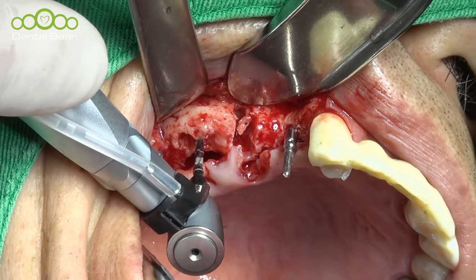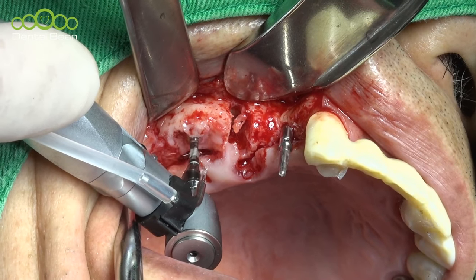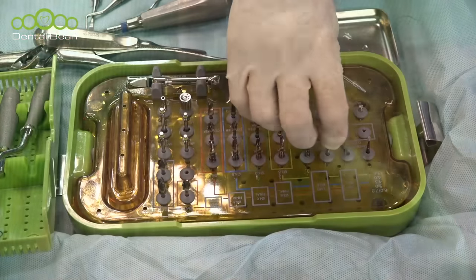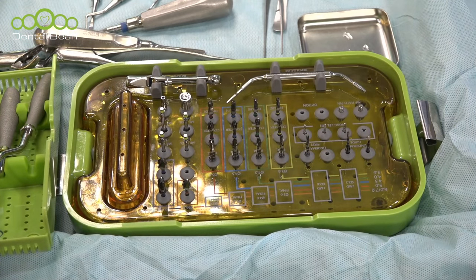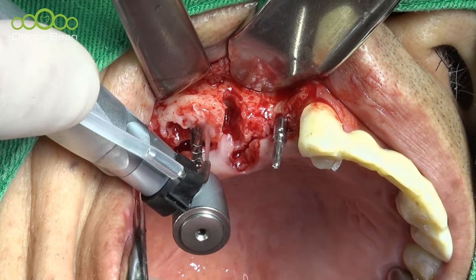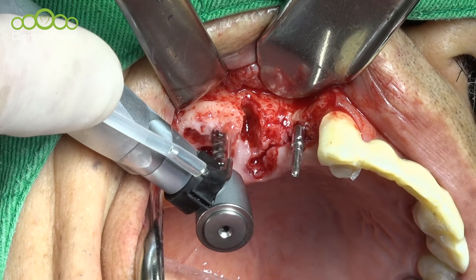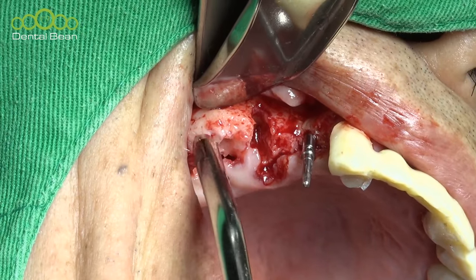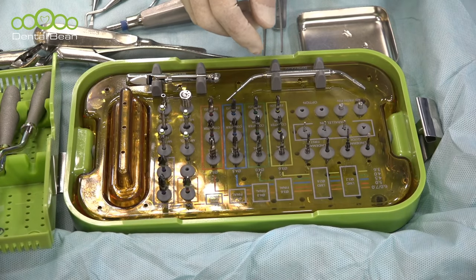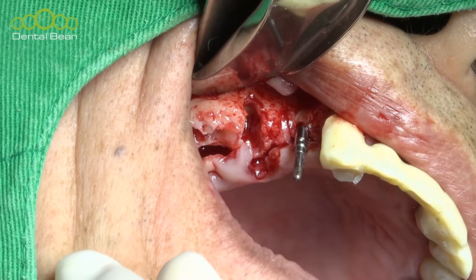So at this time, the bone is very soft bone. Just only 5mm drilling. Next drill, 2.6. Still, 5mm. For a crestal approach, optimal diameter enlargement is until around 3.5. So next step, 3.6.